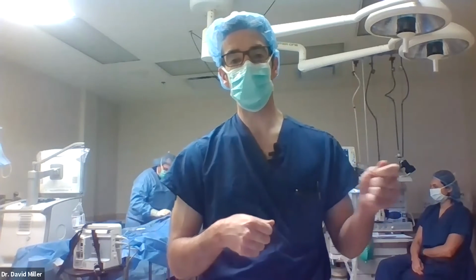Let's see. What is the pressure when doing the scleral depression? You know, the scleral depression doesn't take that much pressure. It's just enough that you can indent the eye. So it's all by feel and vision. It's more than I do in the office because that would be uncomfortable in the office setting. But here under anesthesia, we can get a better scleral depression, putting the rod against the eye and moving it around.